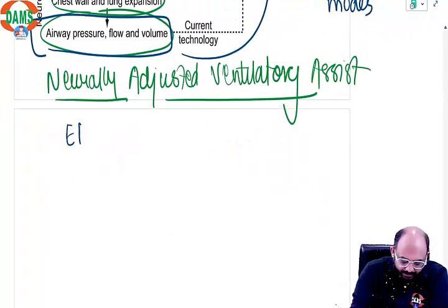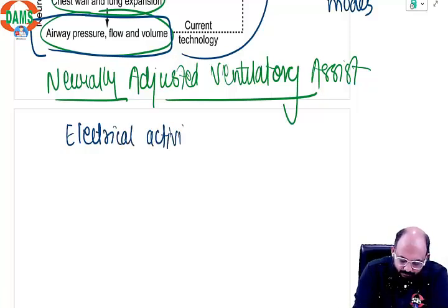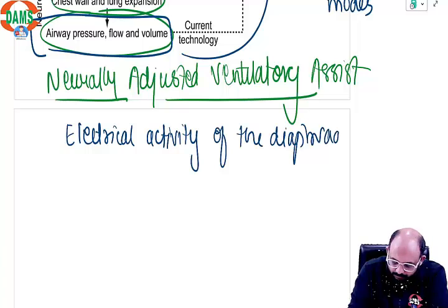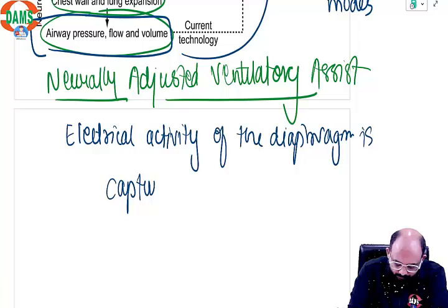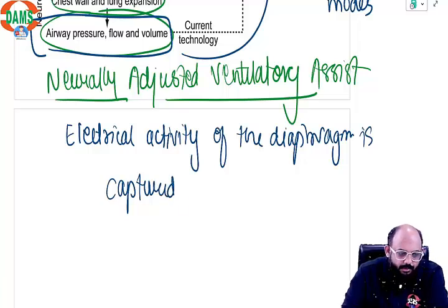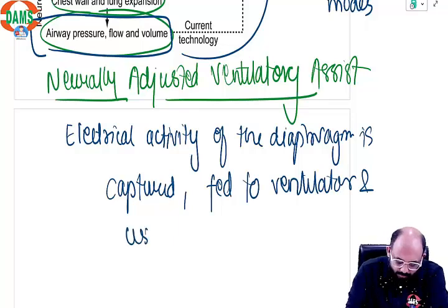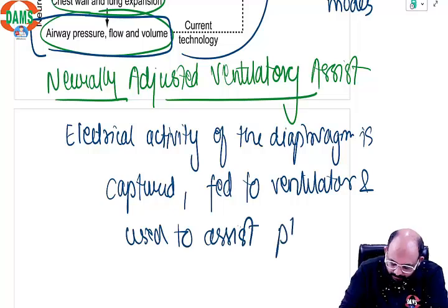So the electrical activity of the diaphragm is captured, fed to the ventilator and used to assist patient breathing.